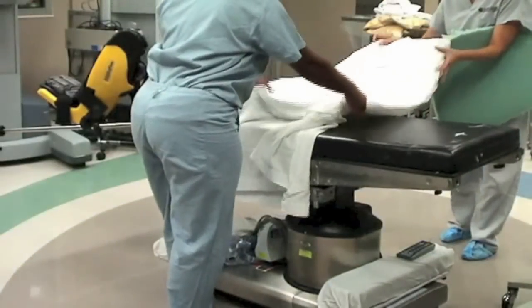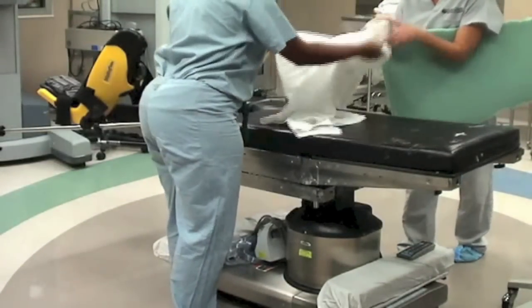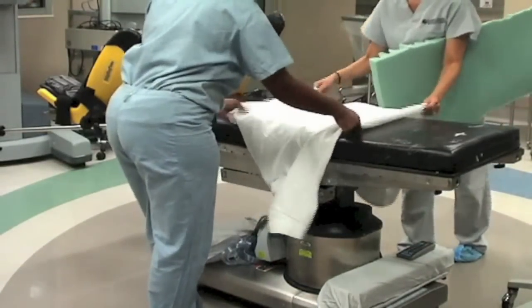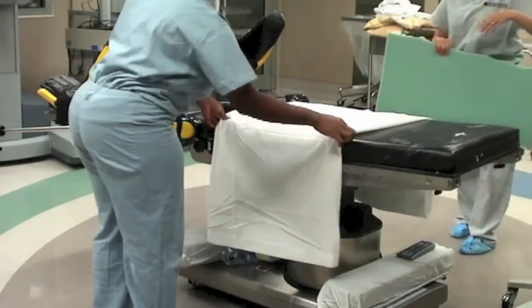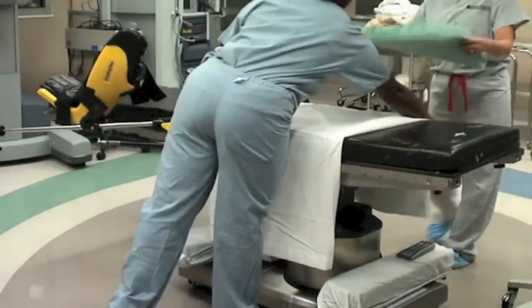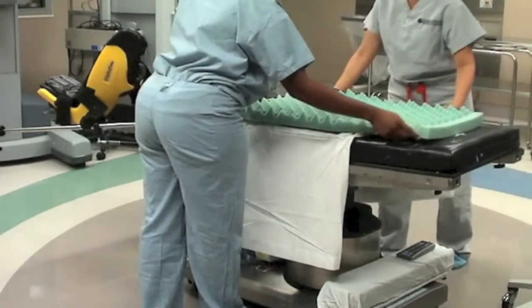A single bed sheet is placed across the head of a bare table, and an egg crate foam mattress is placed over the sheet. This setup prevents the need for taping of the patient to the bed or the use of shoulder braces to prevent slippage of the patient when the patient is placed in Trendelenburg.